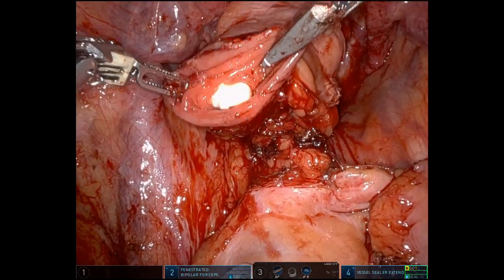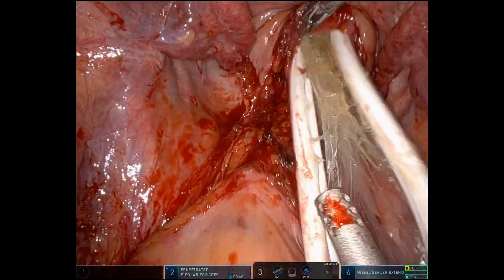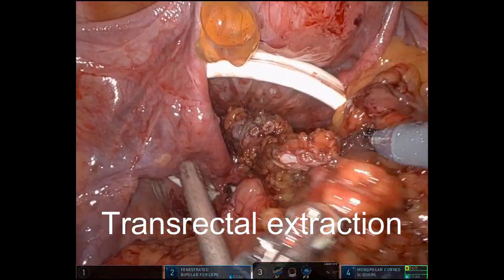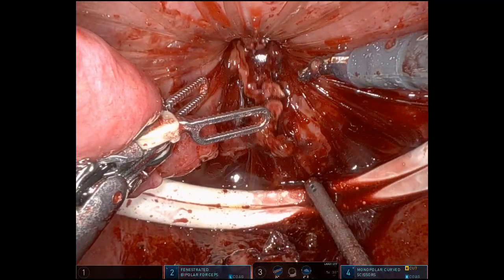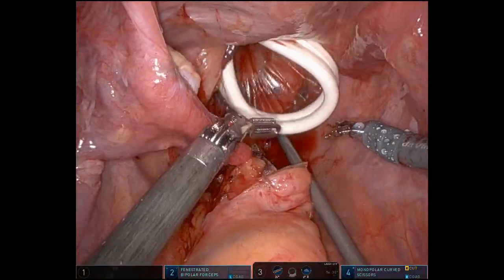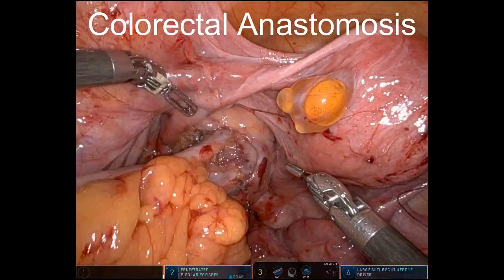This is our Nicely Done series: how to repair a leak at the anastomosis during the NICE procedure. We're picking up the procedure late in the game. We've already resected the specimen, put it in our Alexis, and performed the transrectal extraction. This was a patient that had diverticulitis. Now we're removing the Alexis and preparing for the anastomosis — we're going to go ahead and skip to doing the colorectal anastomosis.